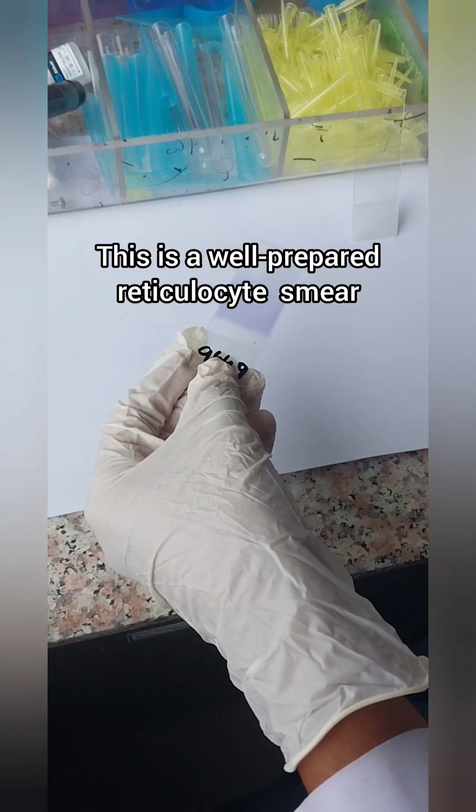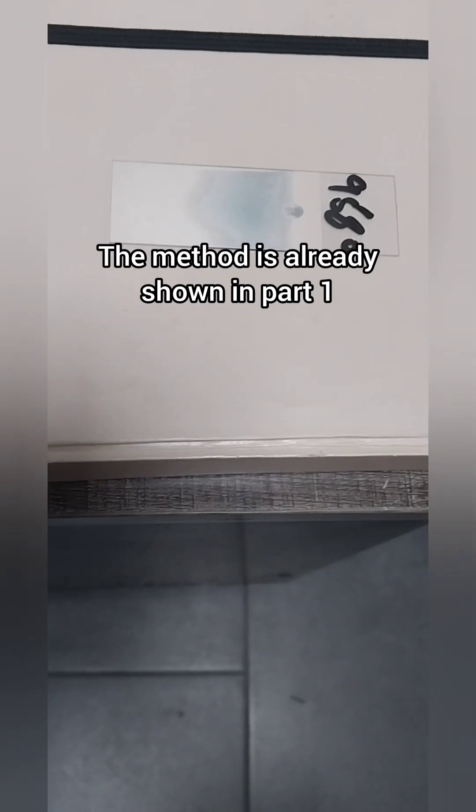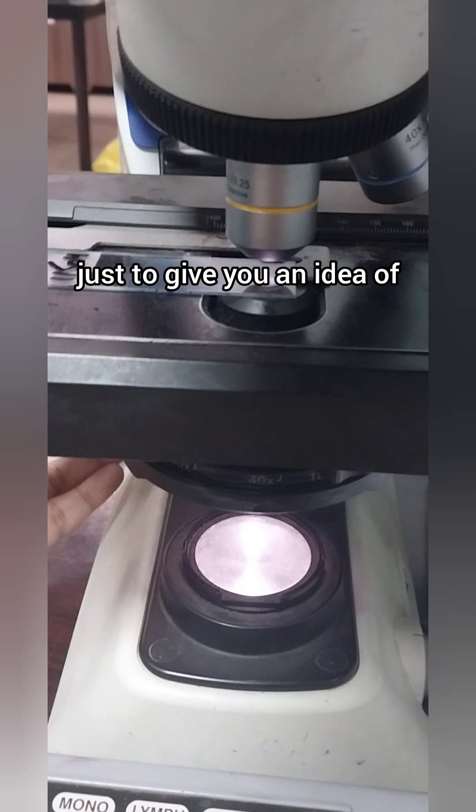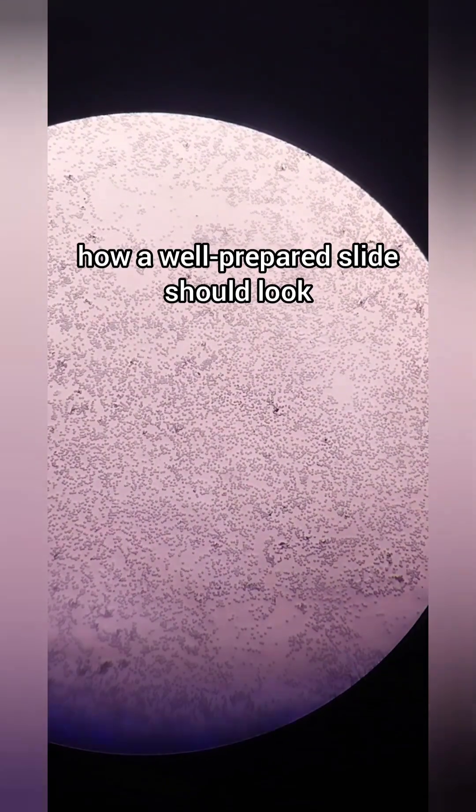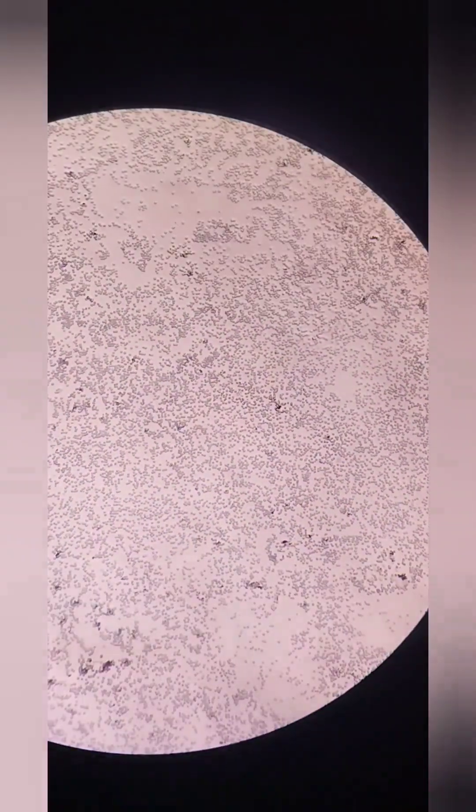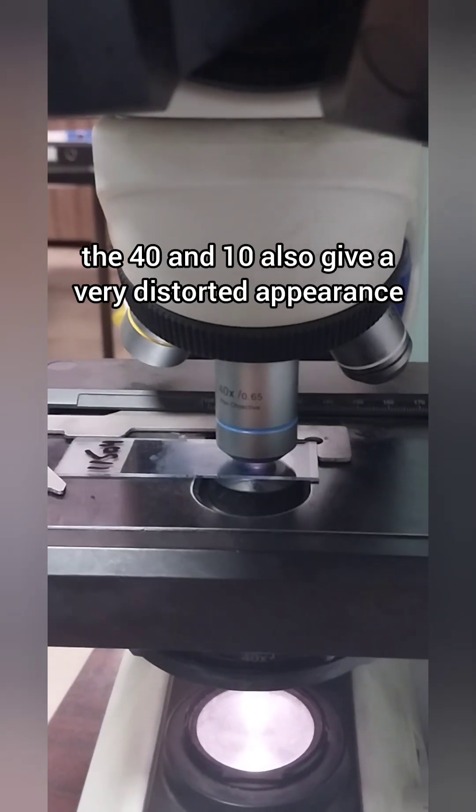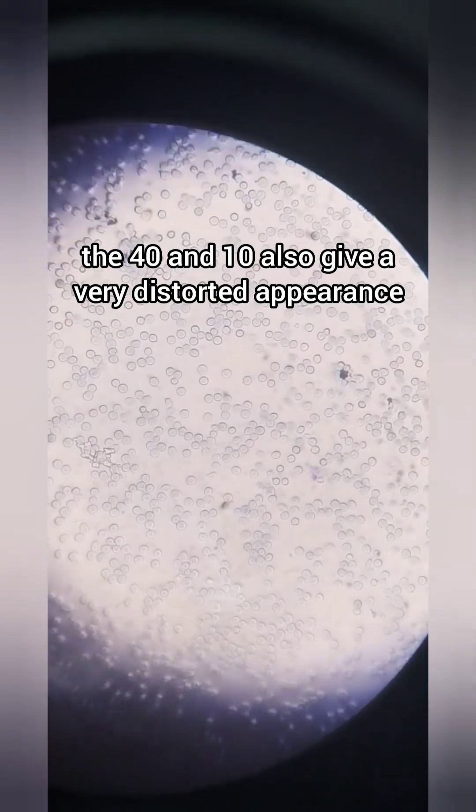This is a well-prepared reticulocyte smear. The method is already shown in Part 1. First, I'm going to show you how it looks on 10x to give you an idea of how a well-prepared slide should look. Otherwise, if the slide is not well prepared, the 40x and 10x also give a very distorted appearance and the color is dim.